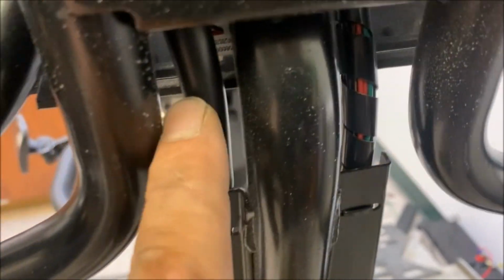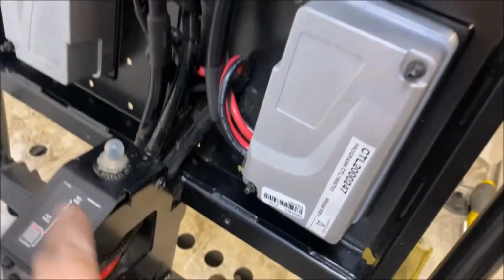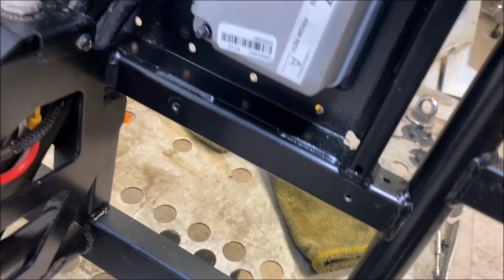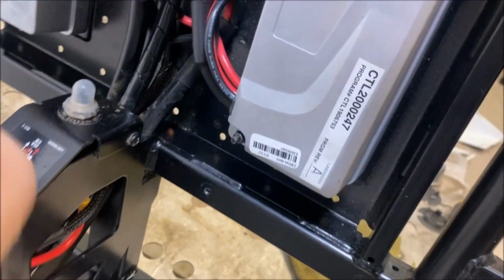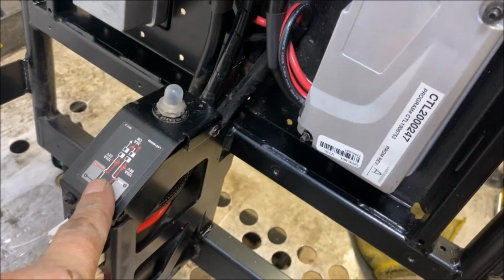Just be careful, there's your wiring there, running down there, and there, that's your 2 main wiring harnesses, front to the 2 controllers, one left and right. And then this main harness block is welded to the frame, so you can't remove that. The only piece you can remove is this piece. You could remove that to take the shroud off, but this articulates enough to manage to get it out.